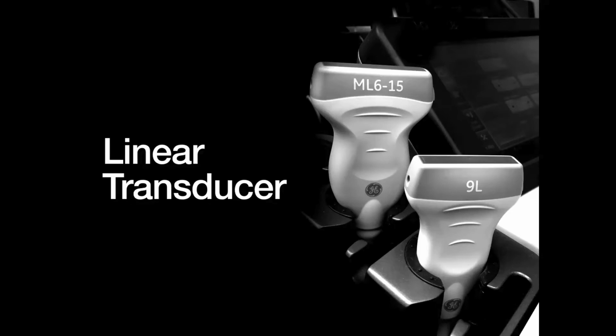And it's actually quite cool, where they'll apply it directly to the eyeball surface itself, or do a little water bath. So they have this little inverted cup that they put in the patient's eye and fill it with water and then put it there. That's obviously not feasible for us because we don't have that transducer. And so when we do it in the ED, at the bedside, at the point of care, the best tool at our disposal is going to be a high resolution transducer, so a linear transducer.